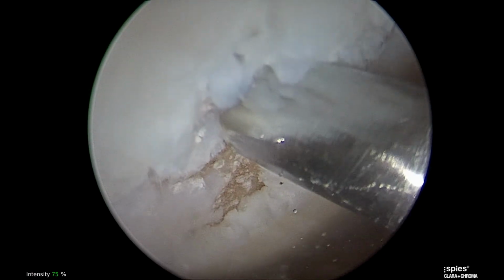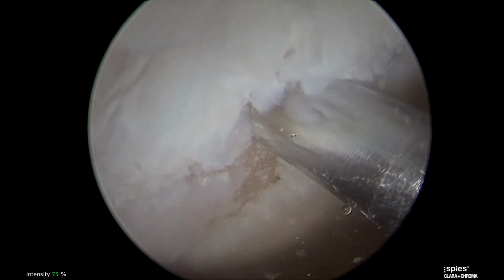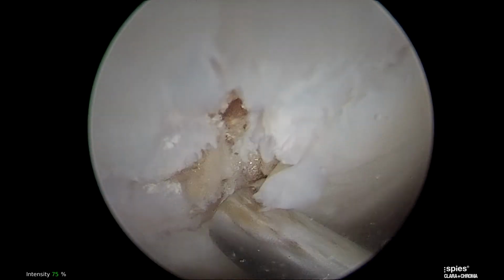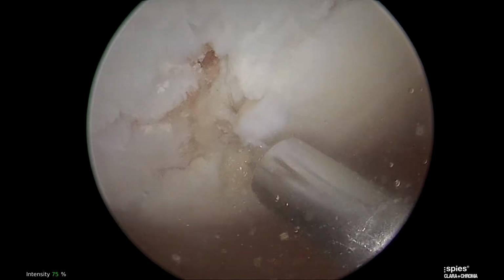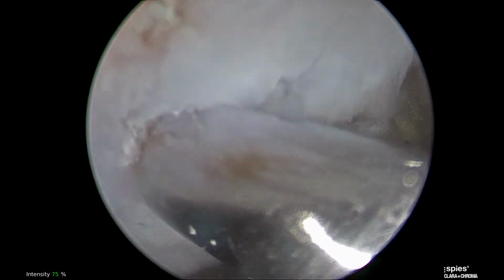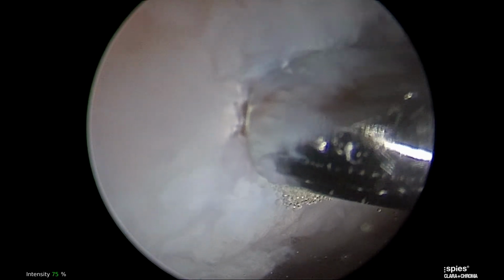So here we are, we're looking at the undersurface of the patella. You can see the lesion here, it's pretty small. It's maybe about 5 or 6 millimeters by 2 to 3 millimeters, but you can see it's starting to delaminate at the edges. And so we put the SmartShot in from this alternate portal. And you can see it's very easy to punch and make this little tiny needle hole in the really hard bone of the patella. And so we've got a couple of little holes there.